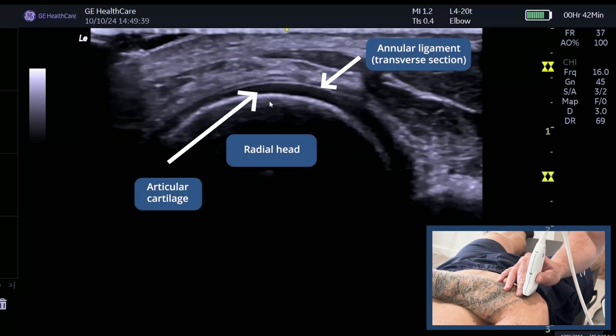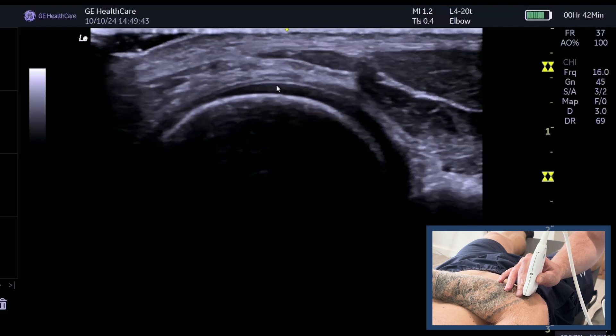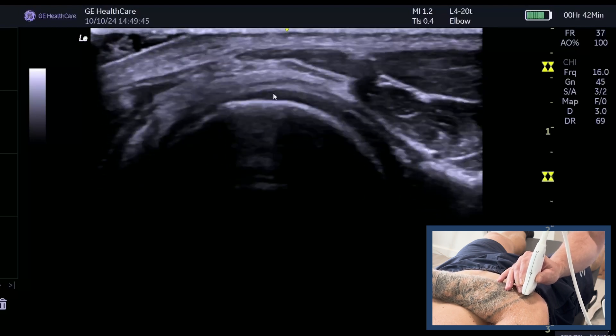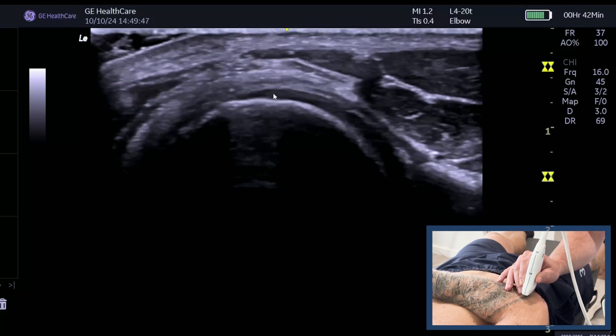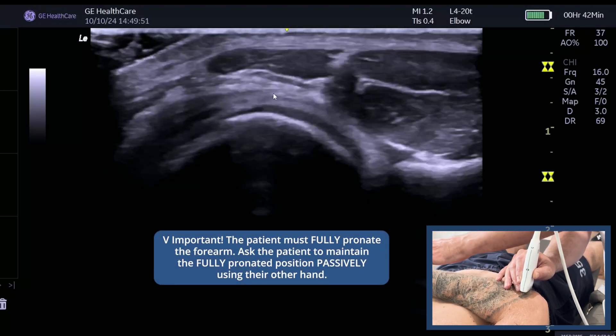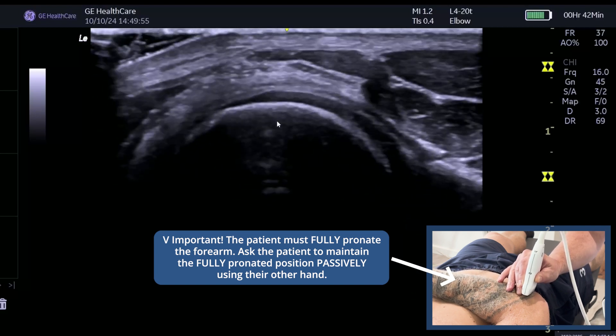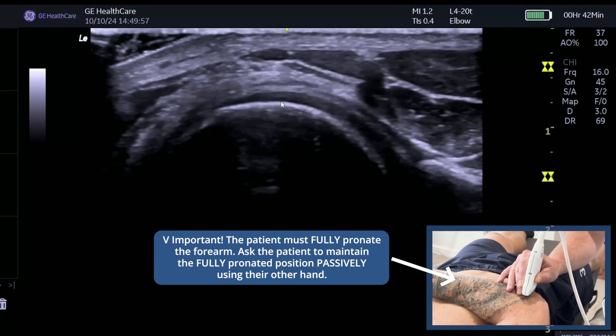First, you can see the probe is transverse on the radial head. You know it's the radial head because it's got articular cartilage on it. The patient is at 90 degrees supine, and I've asked them to fully pronate and keep their hand in that position themselves. That's really important — otherwise you will not see the distal biceps.